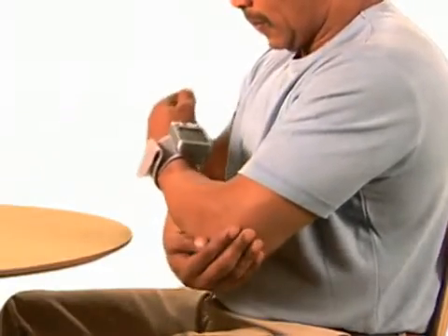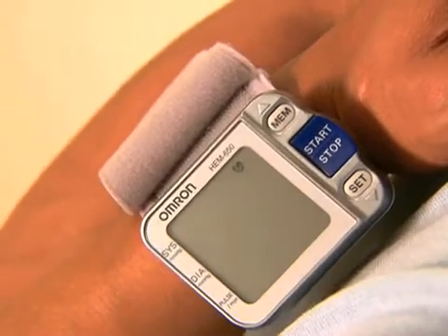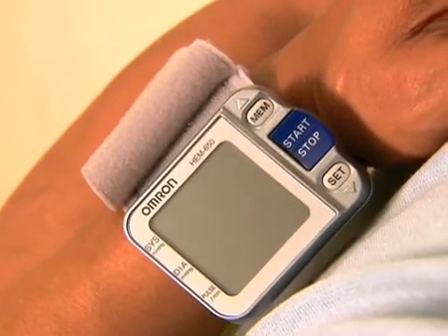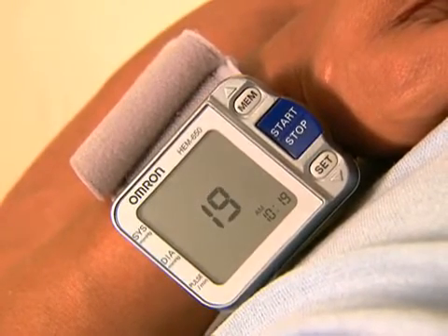Holding your left elbow and arm against your body, elevate your wrist to heart level. The monitor will beep faster as you get closer to the heart zone. Four slow beeps will sound when the unit is in the correct position.